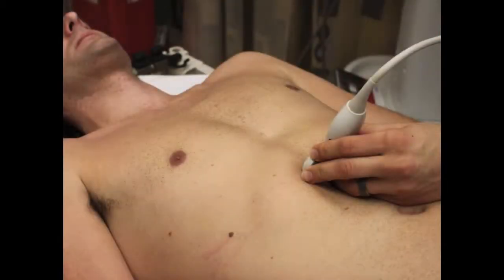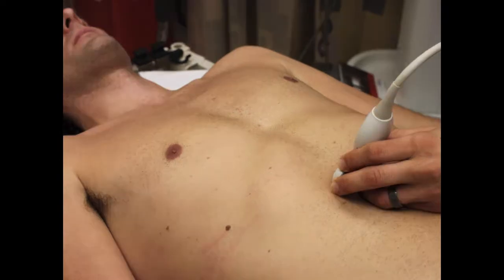When you're placing the probe on the patient, you want to put it in the epigastrum with the probe marker facing over to the patient's right, and you want to scan down until you get to the bifurcation of the aorta into the iliacs.